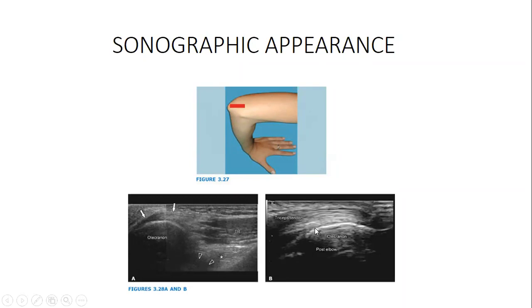You may do an elbow joint, the elbow looks okay, but the patient continues to complain. Pick a probe, try to check whatever you can pick there and guide clinicians so that the patient may benefit from such examinations.